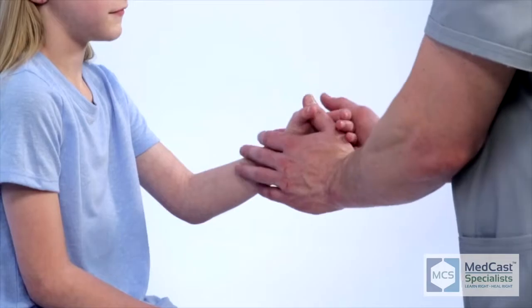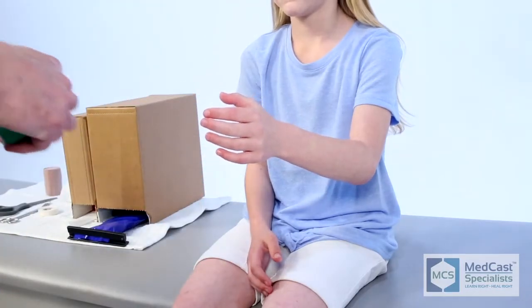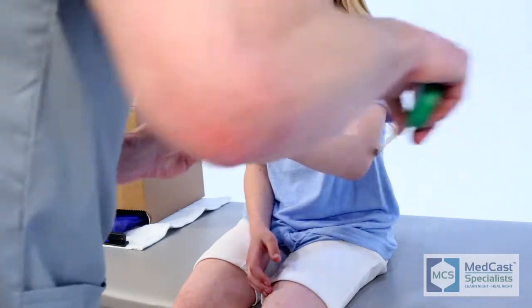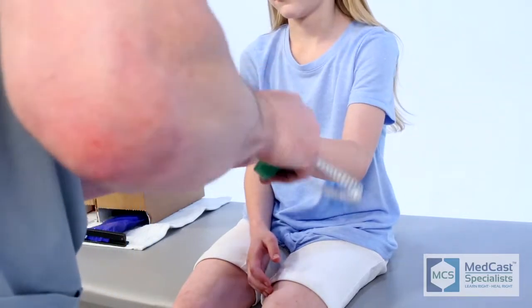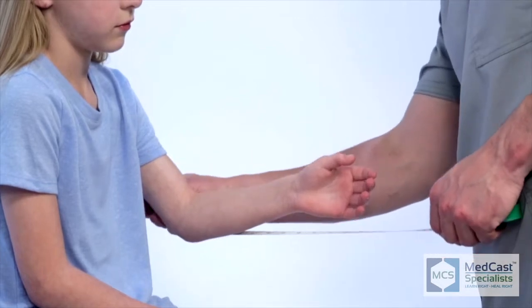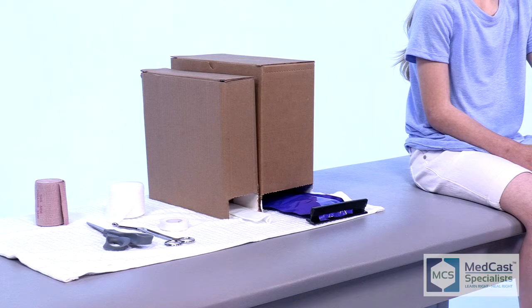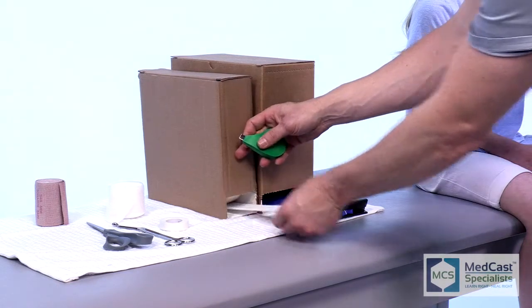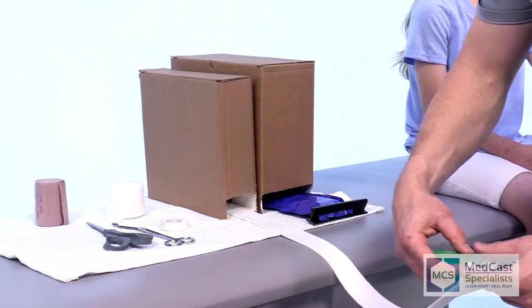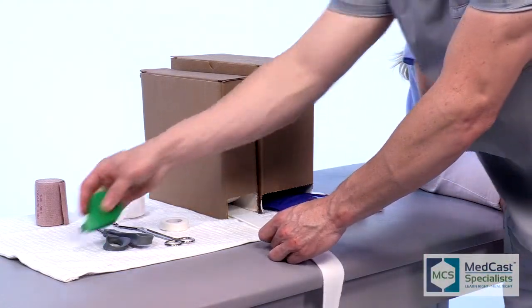For this video, we're going to be showing the application of the sugar tong splint, one of the most common splints you will see in urgent care and ERs. This is one of the most common splints applied for both bone forearm fractures, distal radius fractures — anything that will need to immobilize the patient so that they refrain from supination and pronation.